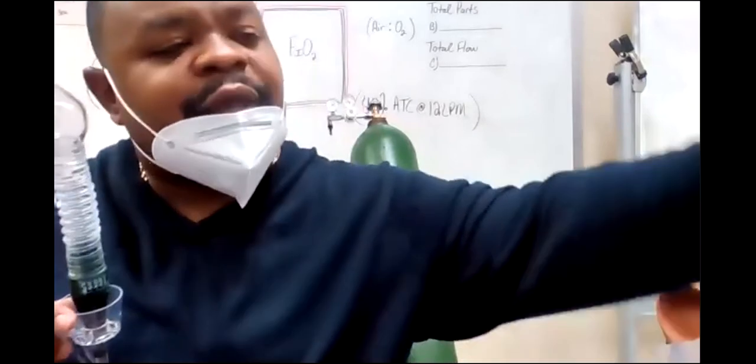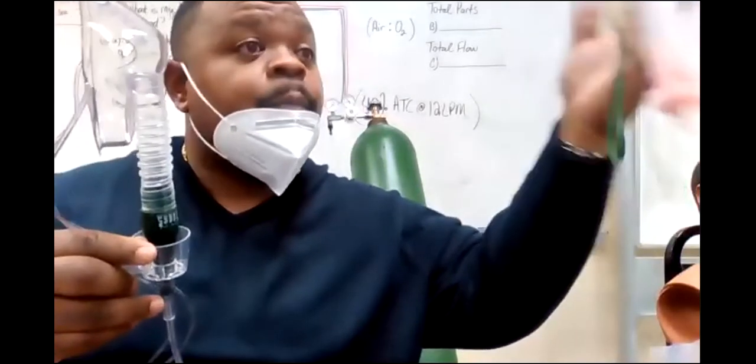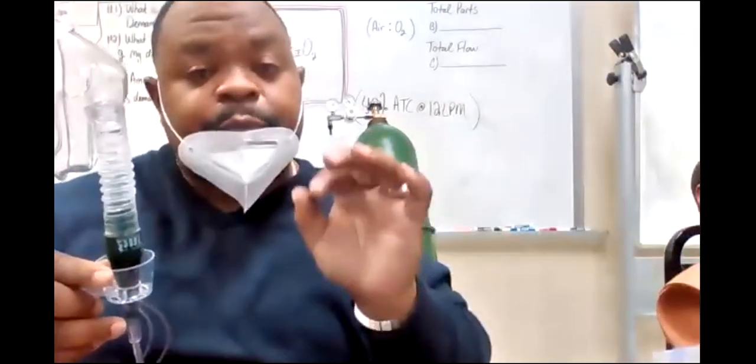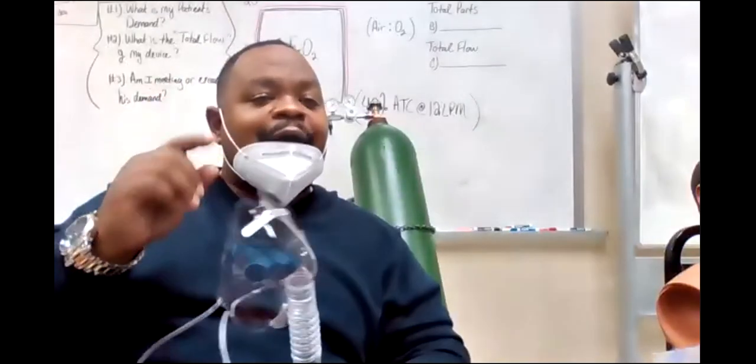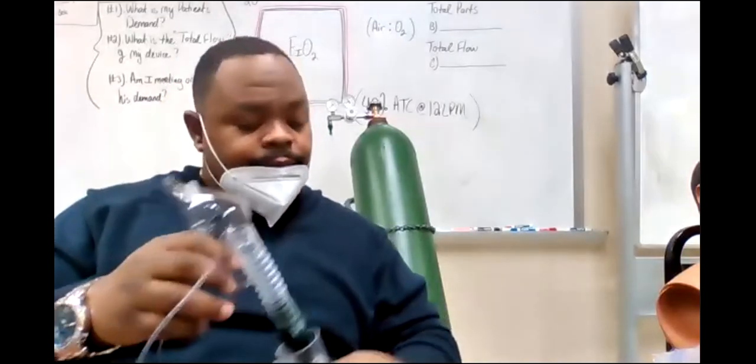Now for the homemade one, we used to have one that fit, this don't fit on the homemade, but you would have one on this one as well, okay? That is the principle of Venturi mask. This is your first high flow system. It's high flow because we can guarantee what?